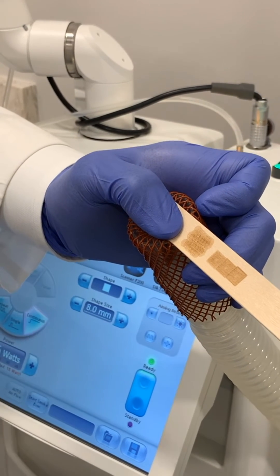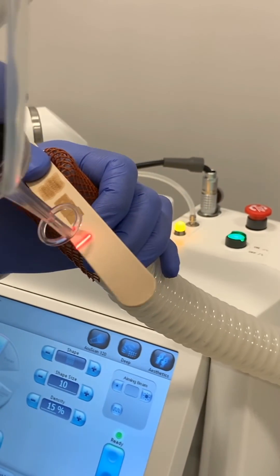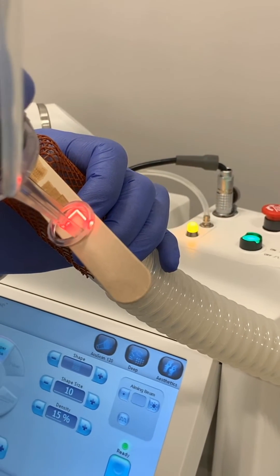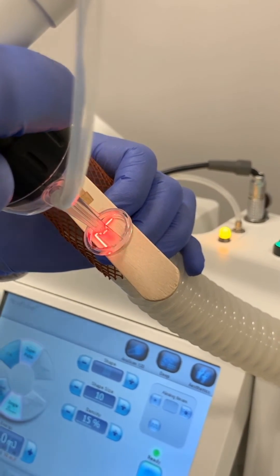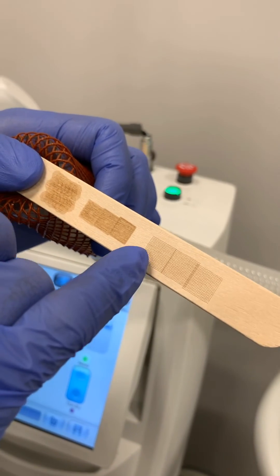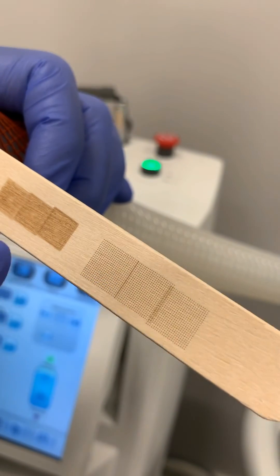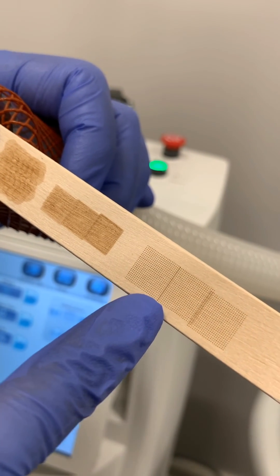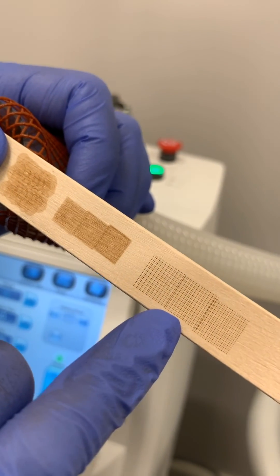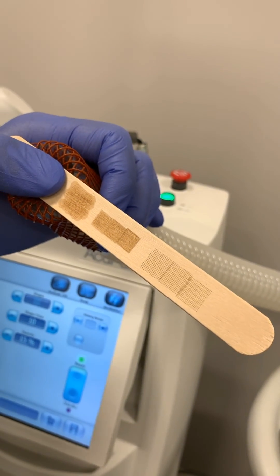Next I'm going to show you the fractional CO2 laser, which drills small little holes in the skin to deliver heat, but preserves some skin in between — you'll see more of a grid-like pattern. On the right-hand side you can see the little drill holes from the fractional CO2 laser. The center is the fully ablative where everything's been removed — more effective but more downtime. The fractional CO2 on the right has intact skin cells, less recovery time, and is still effective, just not quite as much as the fully ablative. That highlights all three lasers.